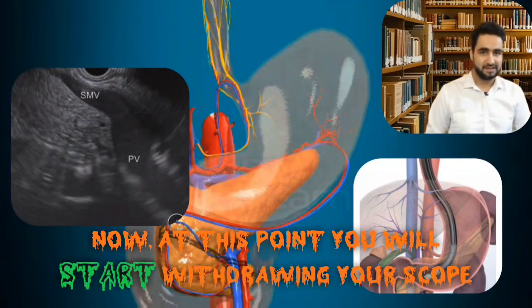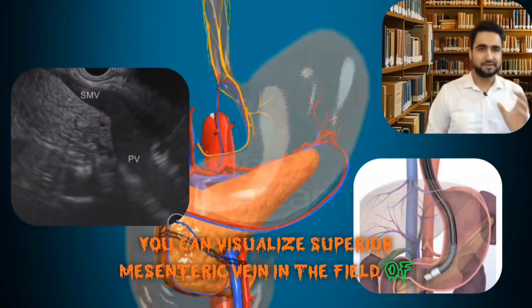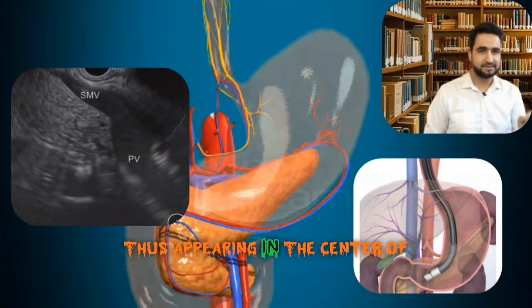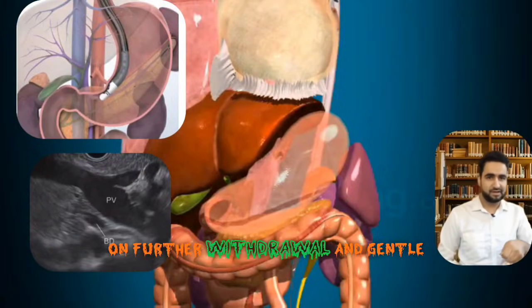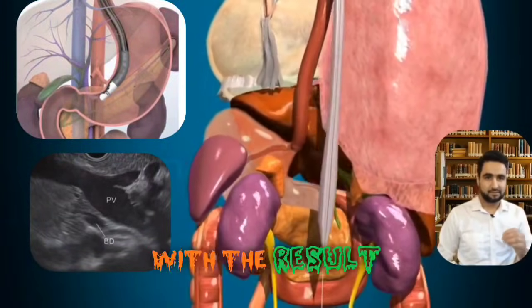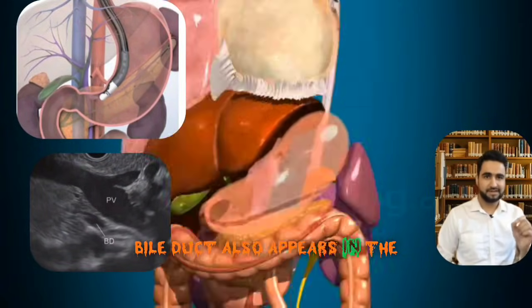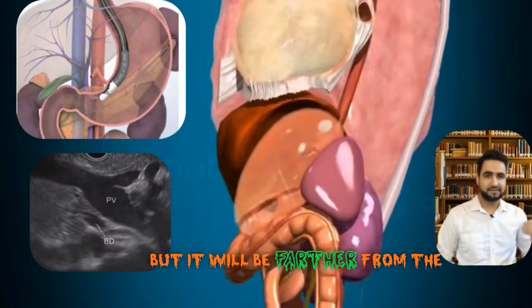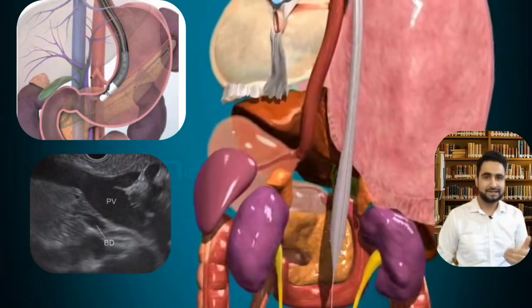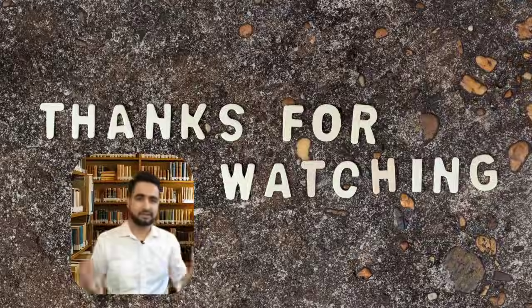Now start withdrawing your scope. Again you can visualize the superior mesenteric vein in the tip beam range on the left side, and the portal vein in the central beam range in the center. On further withdrawal and gentle deflection of the big knob, the transducer straightens, and the portal confluence again comes to the central field. At this point, the bile duct also appears in the tip beam group, farther from the probe. On further withdrawal you can trace the portal vein and bile duct up to the hilum — the bile duct appearing farther from the probe when visualized from the stomach. This concludes the transgastric aortic route.